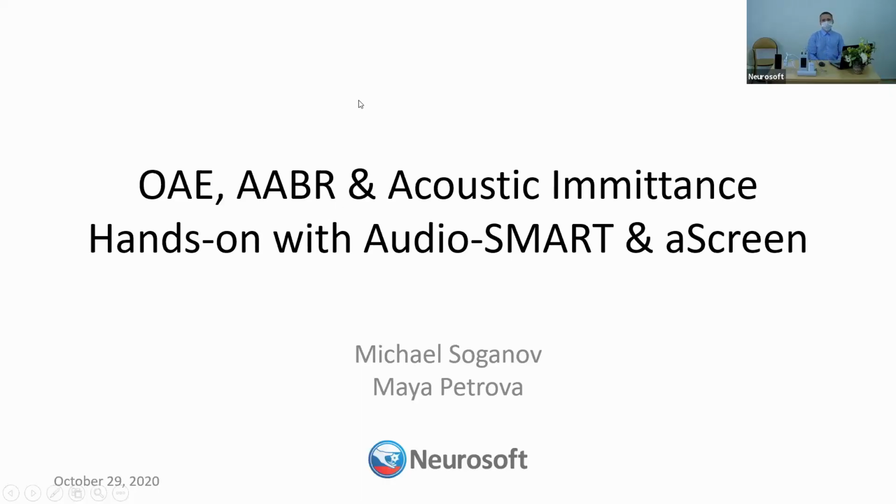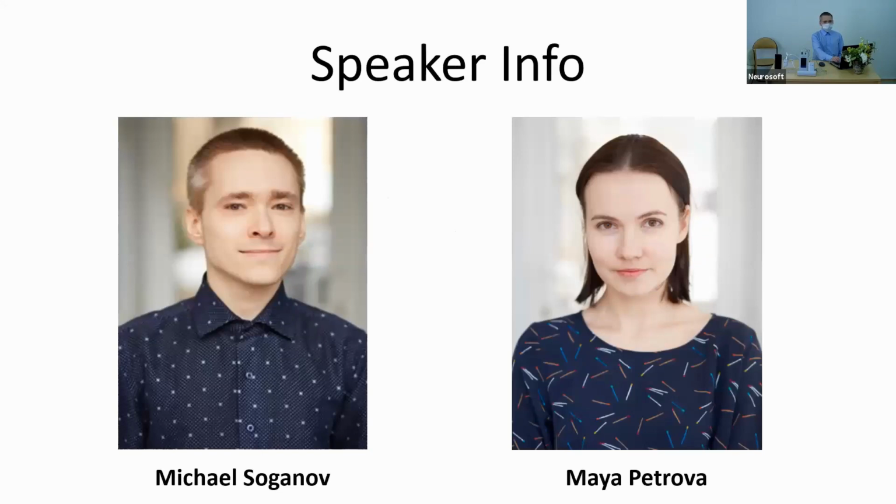The topic of today's demonstration is otoacoustic emission, automated ABR, and acoustic immittance hands-on with AudioSmart and aScreen. Today, Maya Petrova, our clinical assistant, will assist me during the live demonstration.